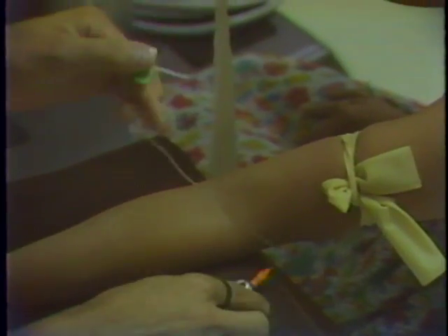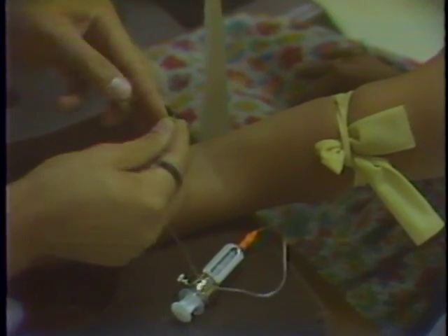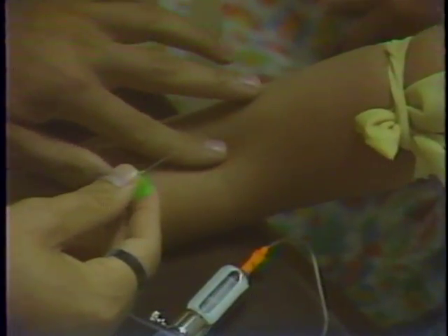Radioactive material inside a person? Well, if you put a lot of radioactive material, yes, but this is a very special kind of radioactive material. It's rather low energy. It is what we call a gamma emitter, so it doesn't have a lot of locally damaging radiation. And it's also in what we call tracer amounts, so it's very, very tiny amount of radioactivity.